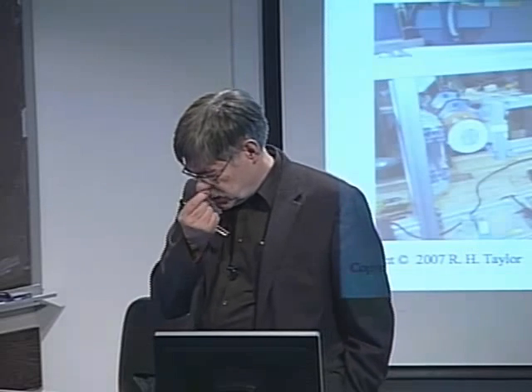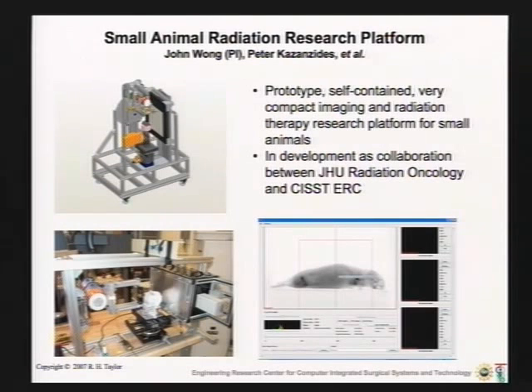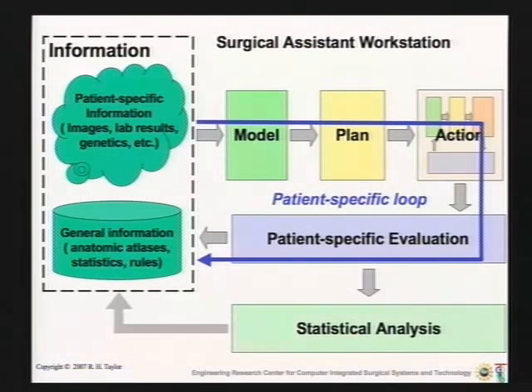This is a current machine. This is a radiation therapy machine for small animals, where what we've done is we've combined cone beam tomography with basically you move the beam around, get the detector plate out of the way, you turn up the power of the beam, and we can put a very highly collimated, sub-millimetric diameter beam for doing radiation therapy in small animals. And it's one-stop shopping. The thing is very small and can be shielded, and you can just put it right in your animal facility. And again, I think the big impact is as an enabler for both cancer therapy and for just basic biology research. So those are some of these examples.